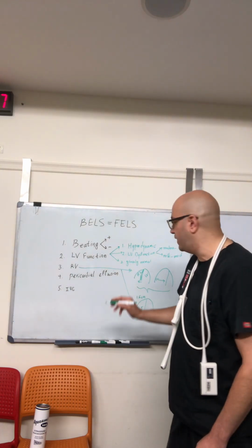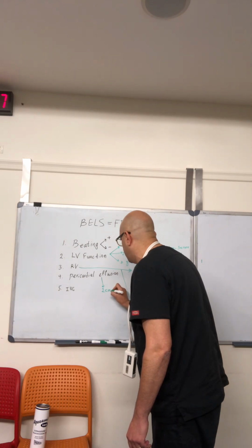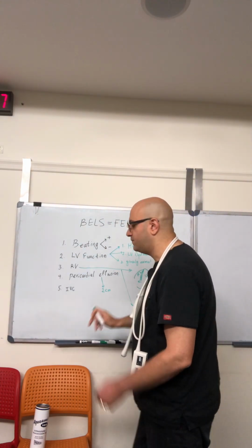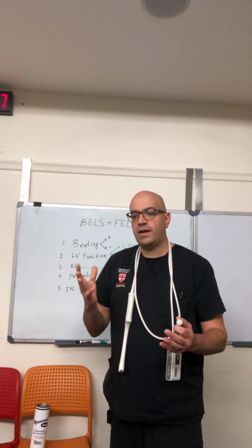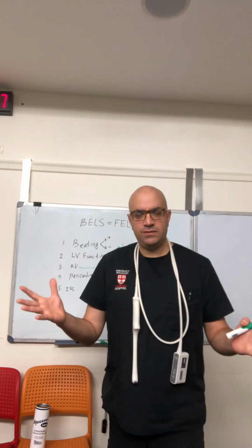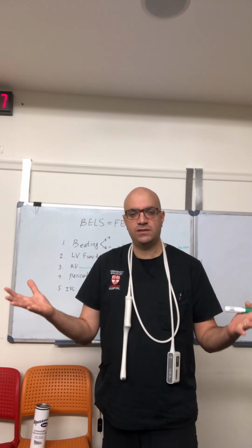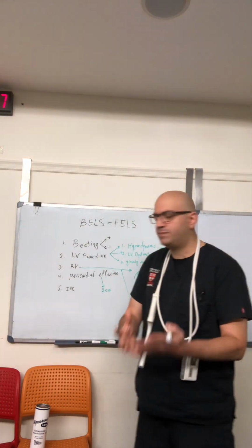Pericardial fluids. Anywhere above 2 centimeters is assumed as large. It's very important to know how long this effusion has been happening. If a 1.5 centimeter effusion happens over years, it's not going to harm. But if a 1.5 centimeter effusion happens in a few hours, it can collapse your RV.